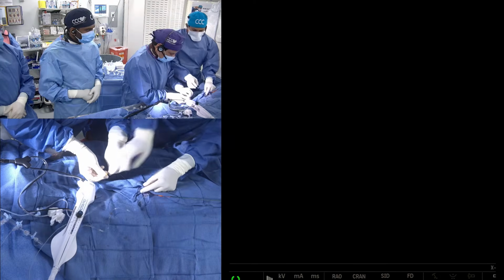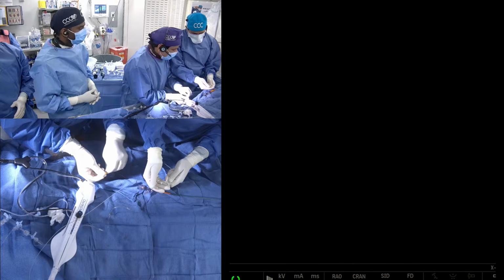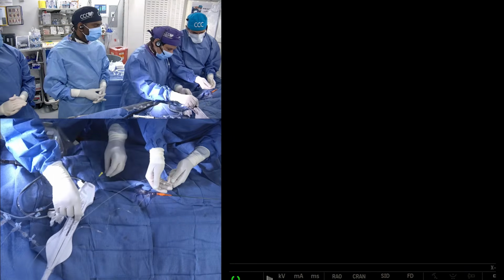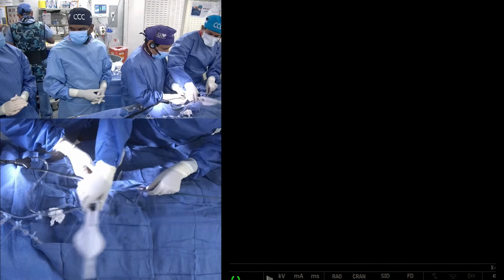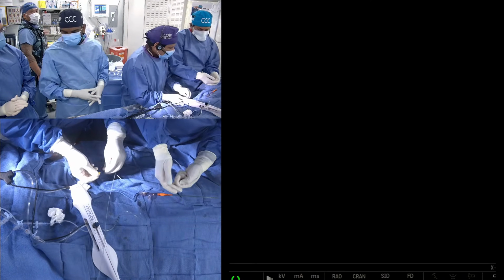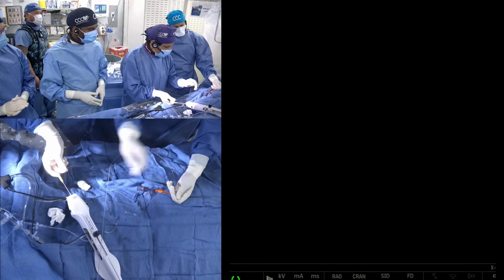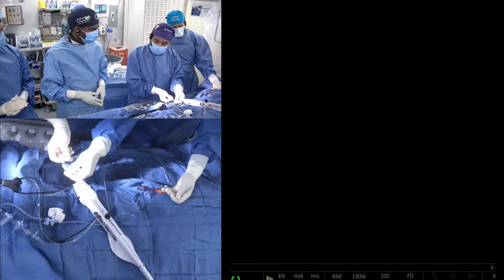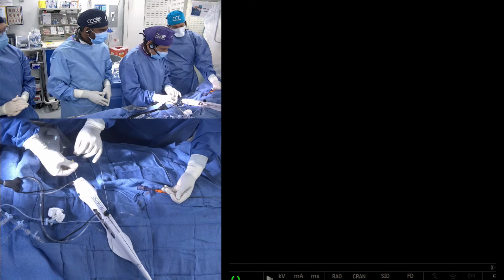This has to be tight. I mean, you have to give me 1 minute to just go through this exercise. Otherwise, we just have to open a new one.